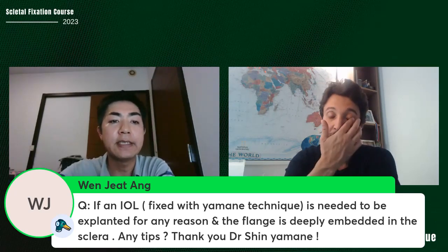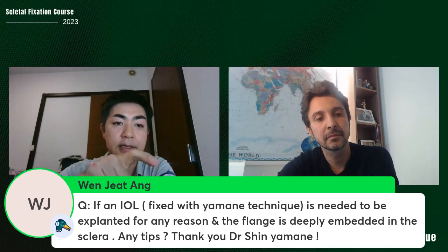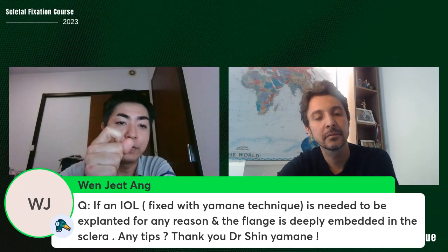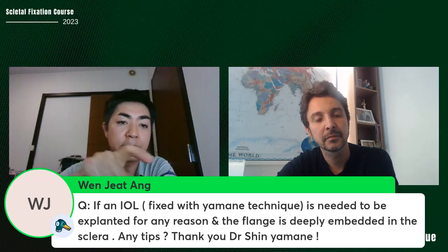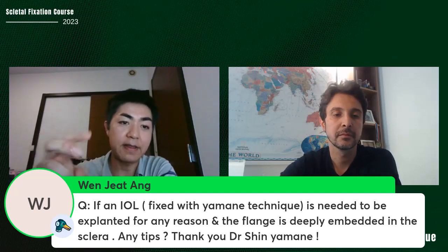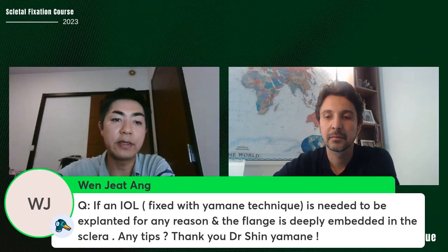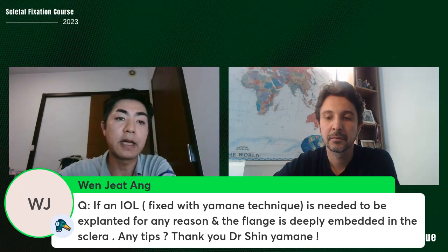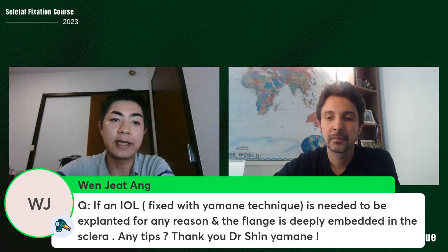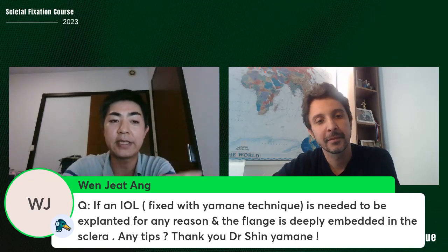Yes, if you can see the flange through the sclera, you can remove it. If you can see the blue flange through the sclera, you can open the sclera and externalize the haptic flange, then cut the flange. If you can't find the flange, you can't remove the haptic. So in that situation, maybe I will cut the haptic inside the eye and leave the flange and the short haptics in the eye. Just remove the optic.